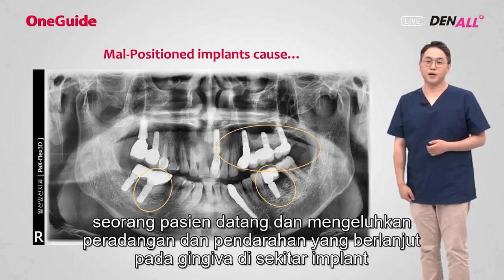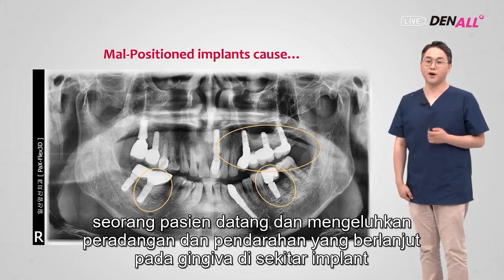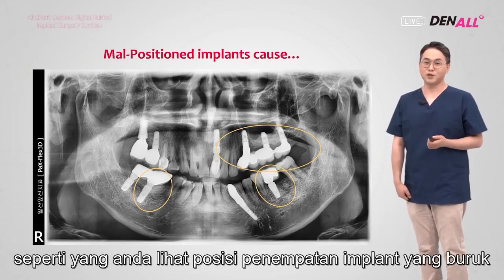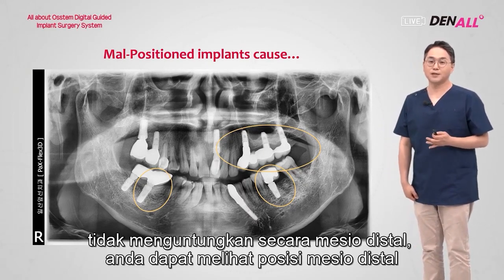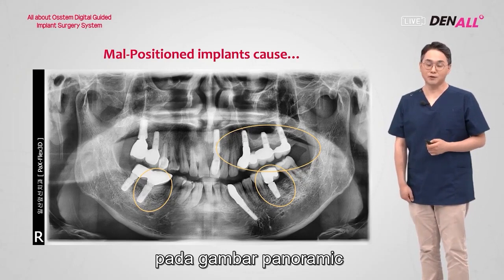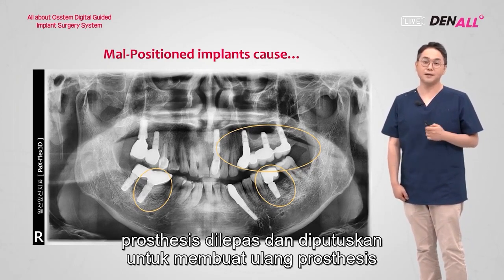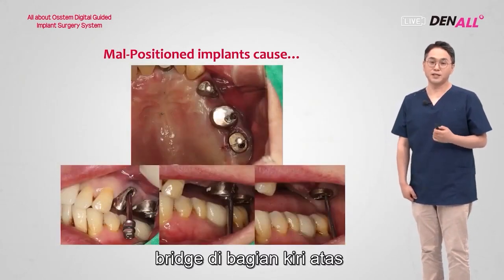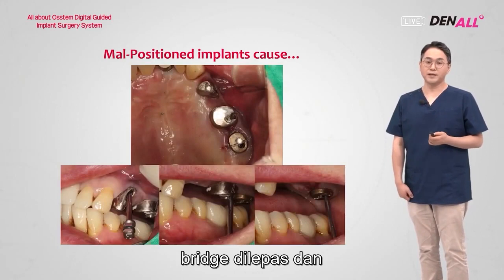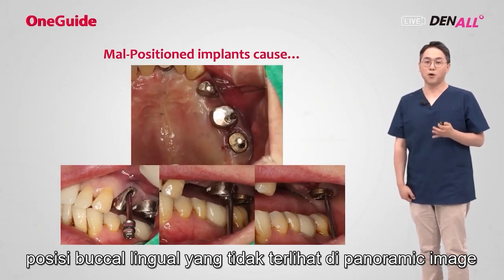A patient came in complaining of continuous inflammation and bleeding in the gingiva around the implant. As you can see, that implant position is very bad. Mesiodistally, it's unfavorable. You can only see mesiodistal position on the panoramic image. The prosthesis was removed and a decision was made to remake the prosthesis. The bridge on the upper left was removed, and if you look here, you can see the buccolingual position, which was not seen on the panoramic image.